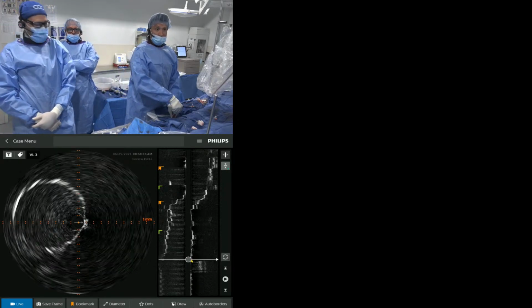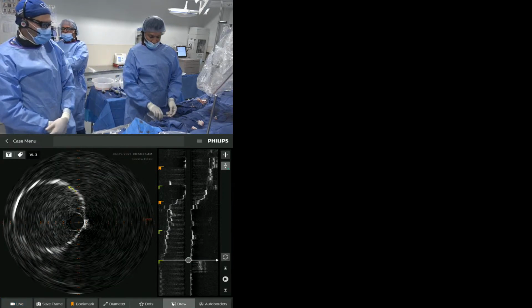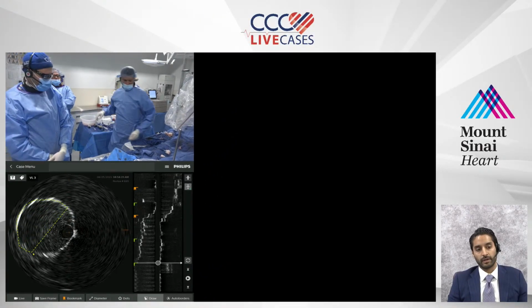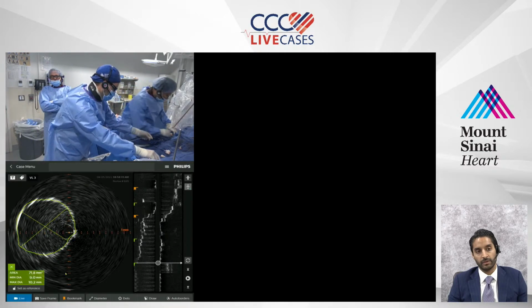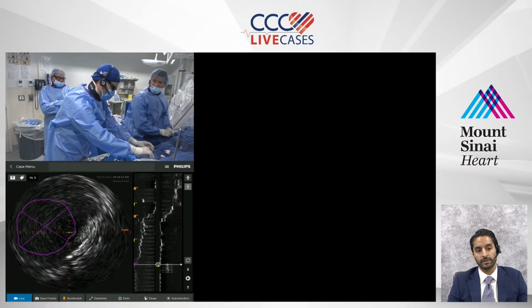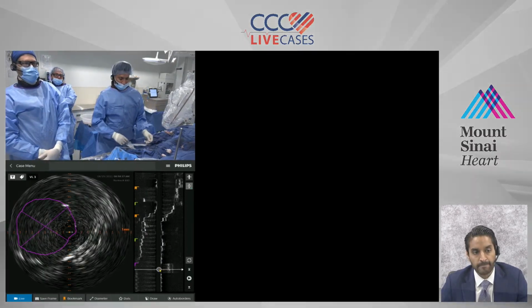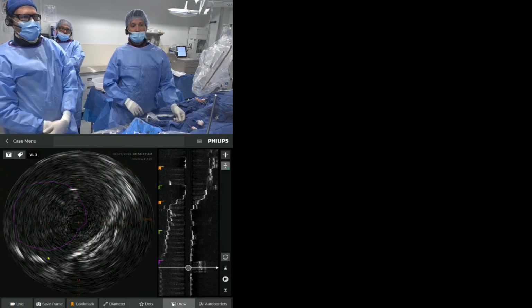So now Karthik is going to do a gradient from the aorta into the left common femoral. Zero both. Dr. Krishan, would you take into consideration the use of Xarelto 2.5 for this patient, dosing up front? Absolutely. Yeah, for this patient I would. I think right now they haven't made the guidelines, but you can see Dr. Guja's enthusiasm. Karthik, tell us what your thoughts are on that.